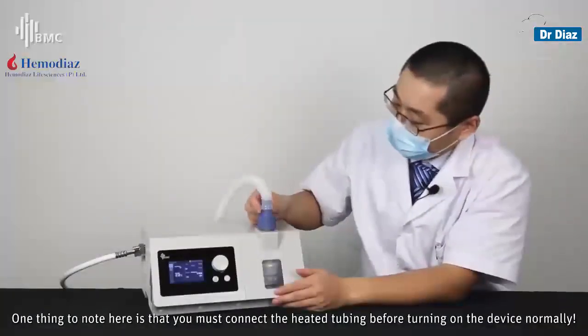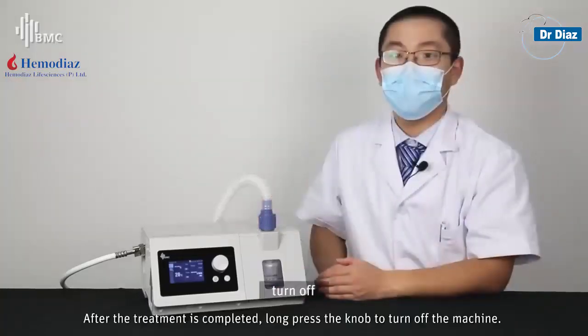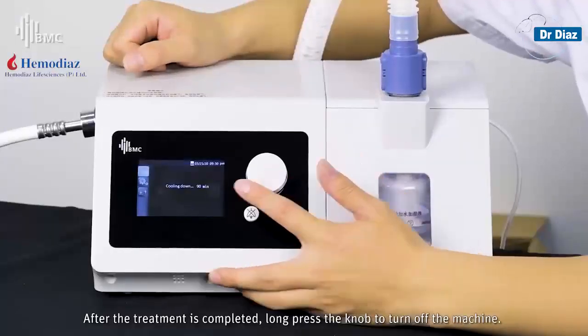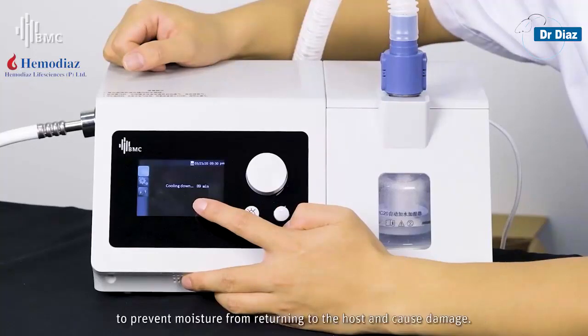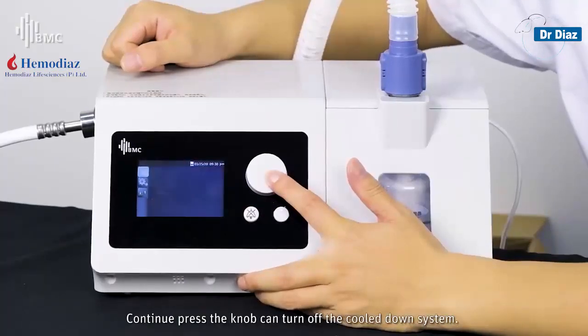One important note: you must connect the heated tubing before turning on the device. After treatment is completed, long-press the knob to turn off the machine. After shutdown, the humidifier will cool down for 90 minutes to prevent moisture from returning to the host and causing damage. Continuously pressing the knob can turn off the cooldown system.